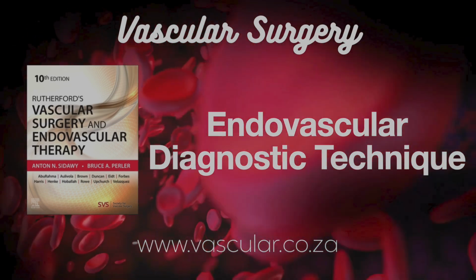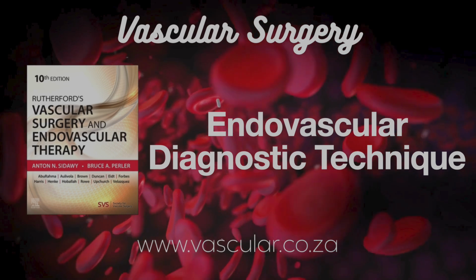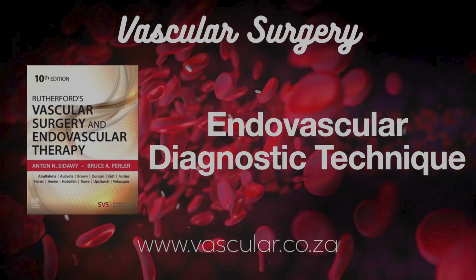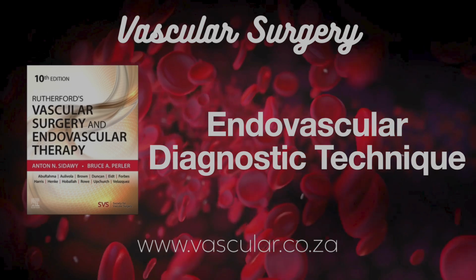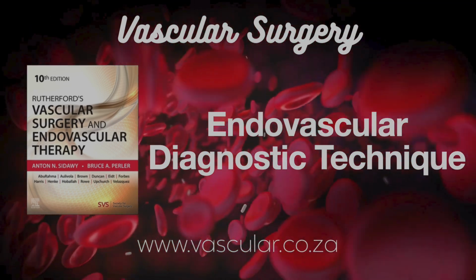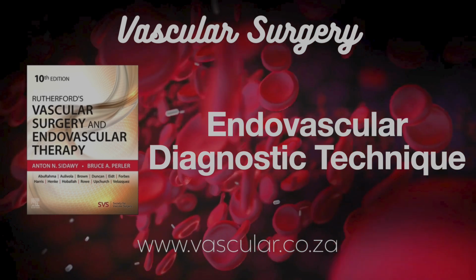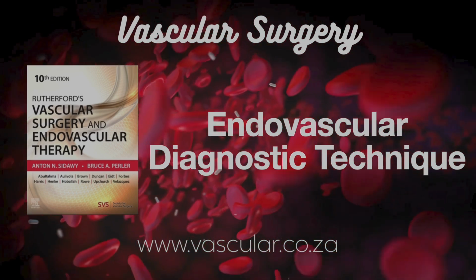Simmons 1 versus 2. Simmons 1 has a shorter side arm, sometimes easier to manipulate. Simmons 2 is longer, maybe better for reaching the right carotid or subclavian via the brachiocephalic. Yeah. There are also self-forming ones like the VTK. Once you're in the carotid, carefully inject contrast, usually by hand or maybe a very low-pressure power injection if stable. Say 4 ml/sec for 8 ml total, get your images.